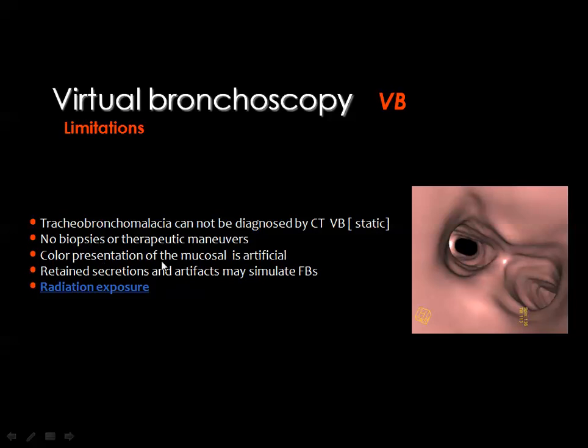The color presentation of the mucosa is artificial, and that's to say you cannot diagnose by this virtual endoscope any mucosal abnormality like congestion or ulceration. Retained secretions, and this is very important, may simulate foreign bodies like mucus plugs, and the secretions will appear similar to the foreign bodies. And what's very important in the pediatric age group is the radiation exposure, which we should take care about.